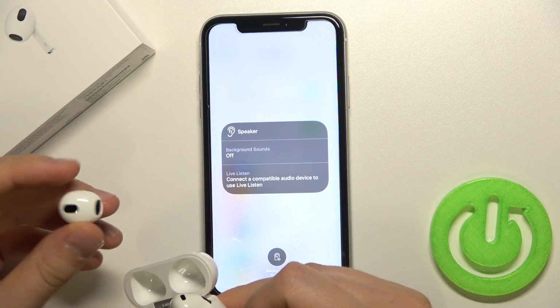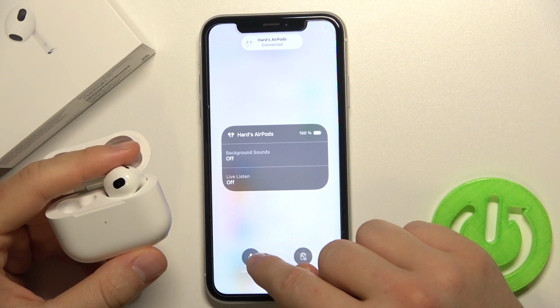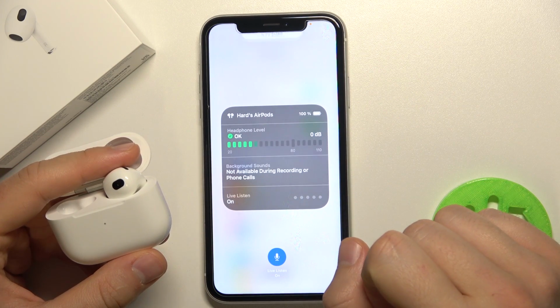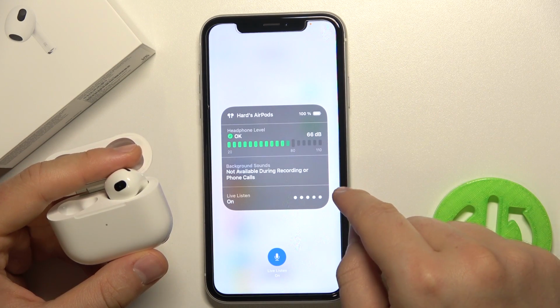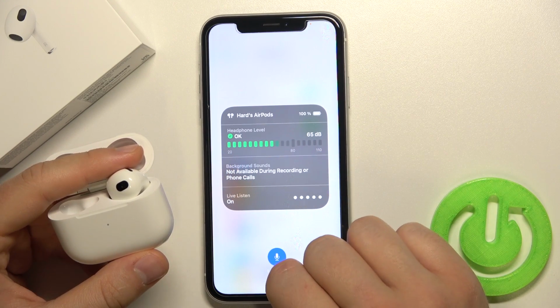Next, let's turn on one of the AirPods, just put it to your ear, and then we can enable the Live Listen. And right now, we can also measure this sound level with the decibels.